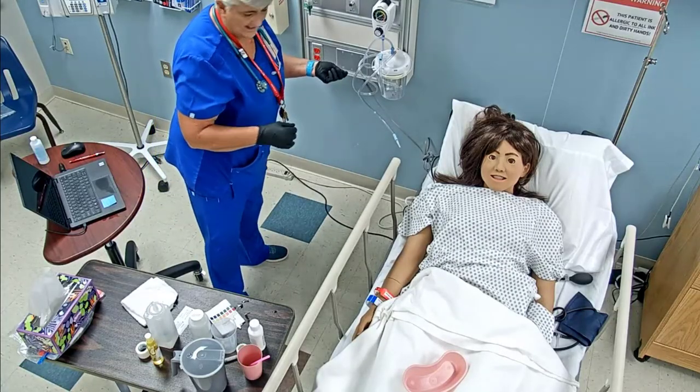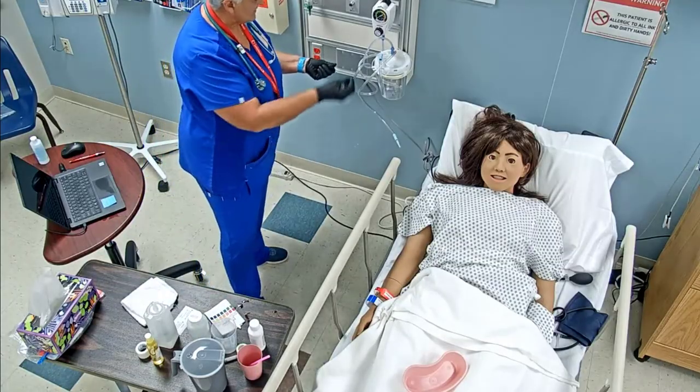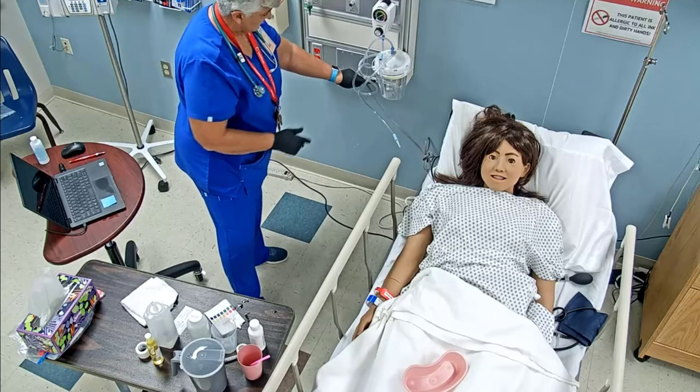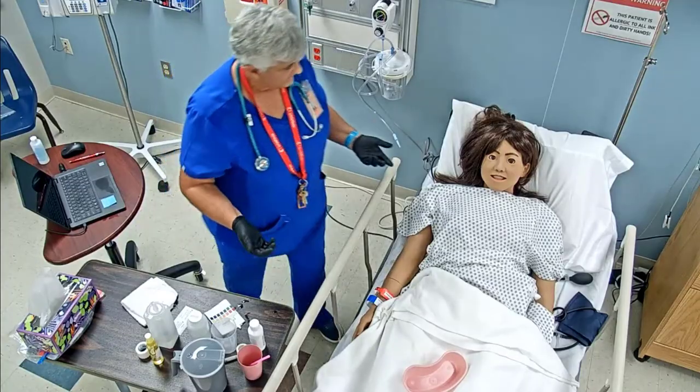Now with the I's and O's, if I had flushed with the normal saline, I need to subtract however much I flushed from the amount, because we want to know what the output was, and not that.